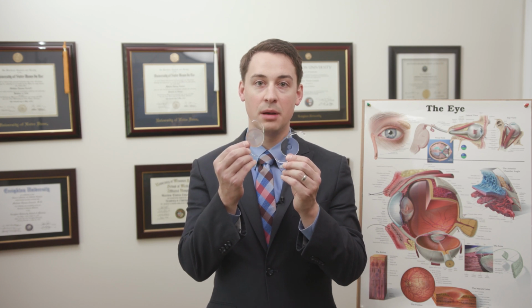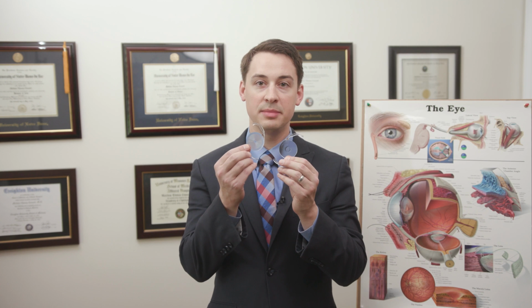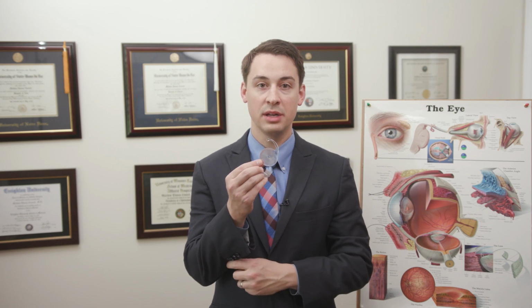However, your near world and your far world are at different distances from your eye. Therefore, lenses have been developed to focus light from both these distances simultaneously. Multifocal lenses split the available incoming light. This means half your available light is being focused at far, with 1/4 of the light at near and 1/4 at intermediate. Thus, multifocal lenses are only advised for patients who strongly desire less reliance on glasses and are not advised for those wanting the most pristine vision quality.